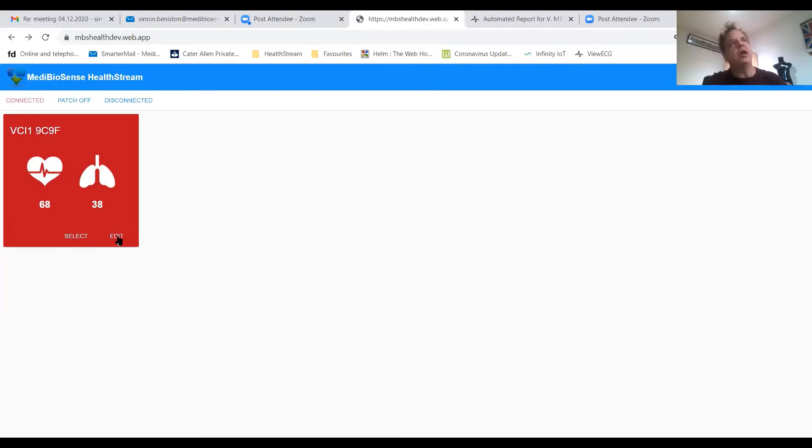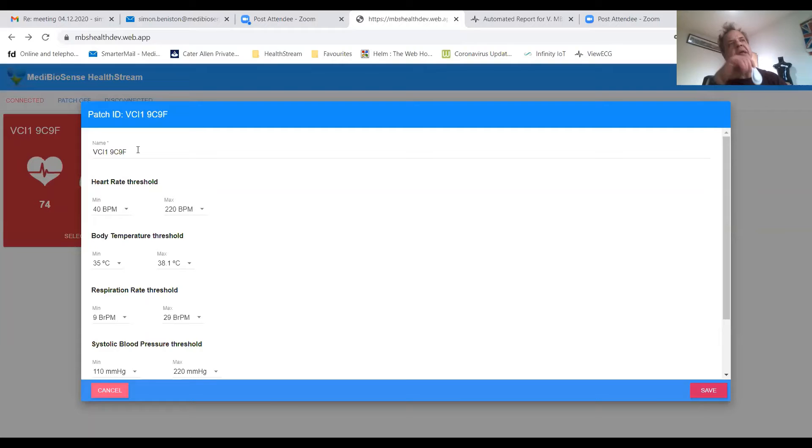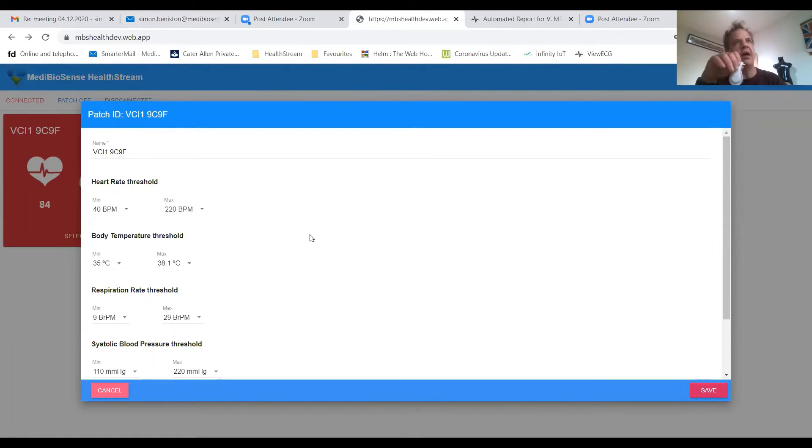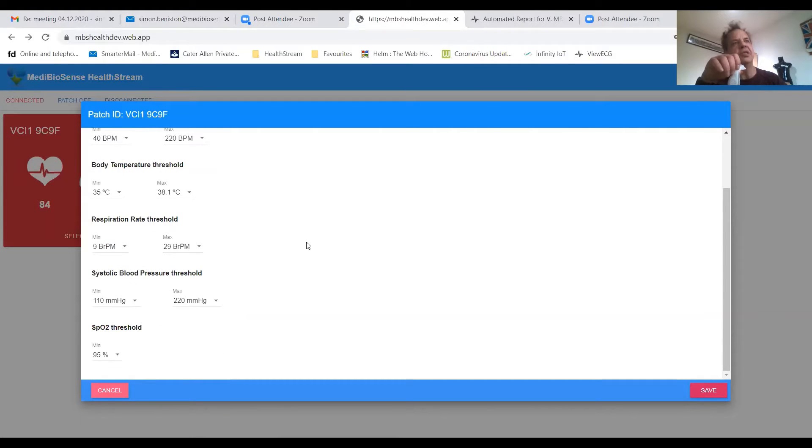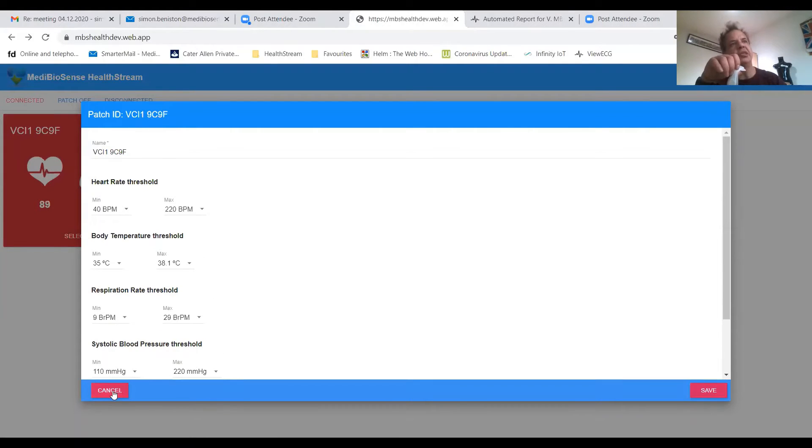This one's set quite high but in here you can change the name of the patch ID so no patient data is transferred, but you can change the name to a patient name and you can do the settings for threshold alerts.